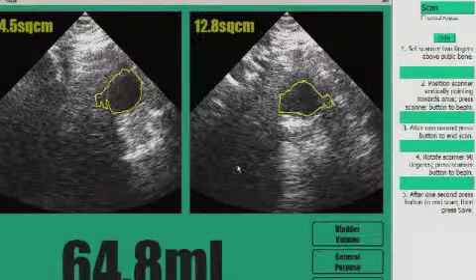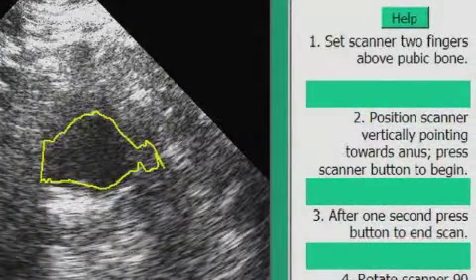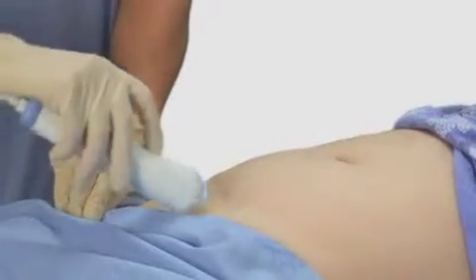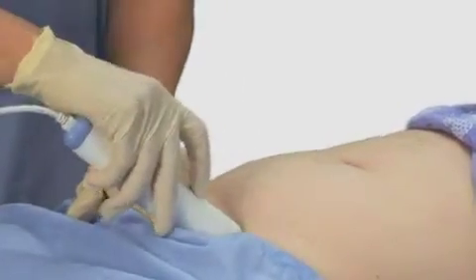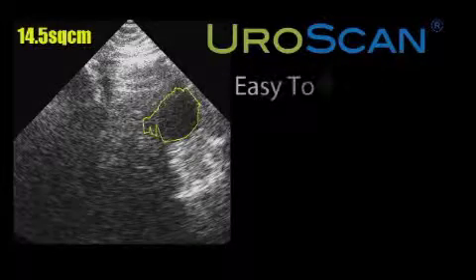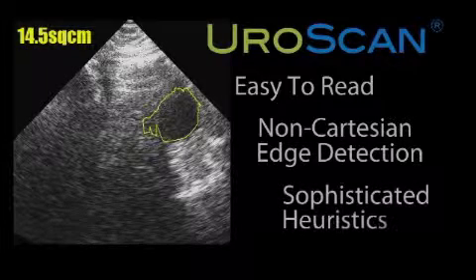Operating the EuroScan is really quite simple. The instructions for operating the instrument are always on the right-hand side of the computer screen — there's no need to memorize this device, as it tells you how to use itself every time you operate it. Orient the device with the button towards the chin, two fingers above the pubic bone, press into the patient's abdomen, and press the button. On the screen, in 256 shades of gray, a large image appears that makes it easy to identify where the bladder is.